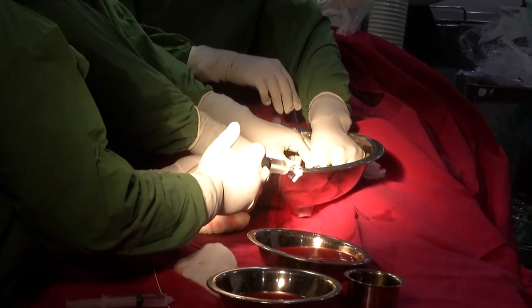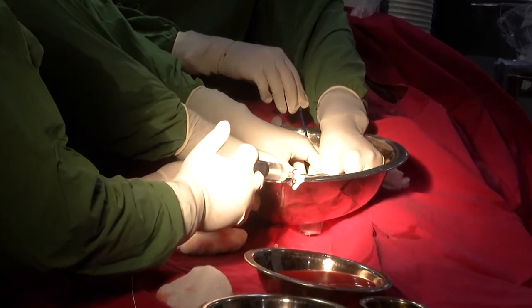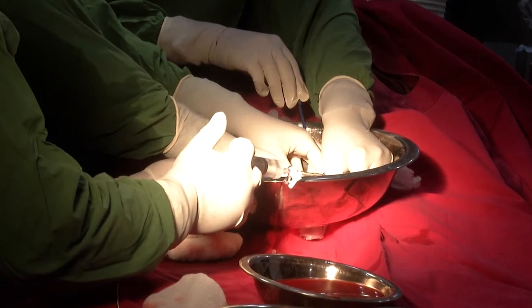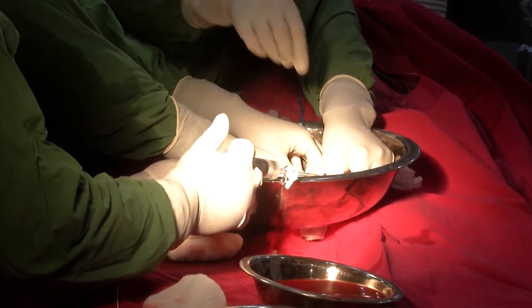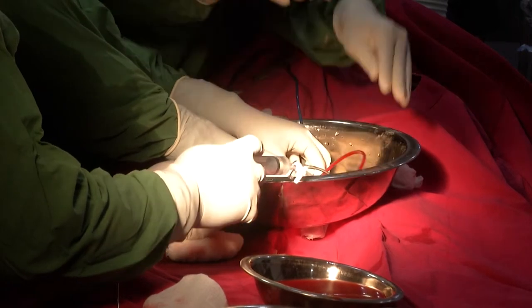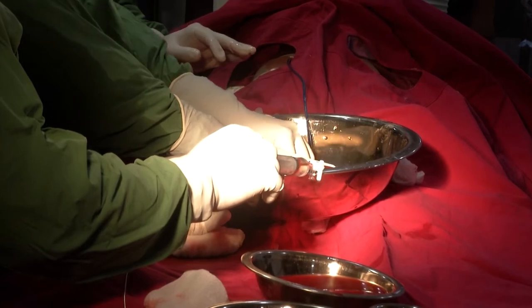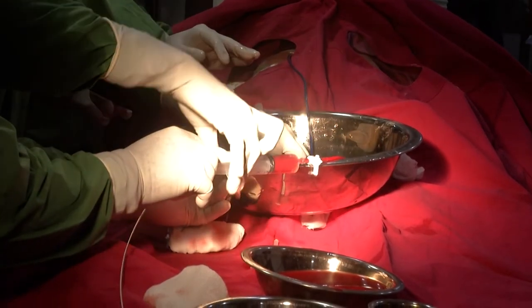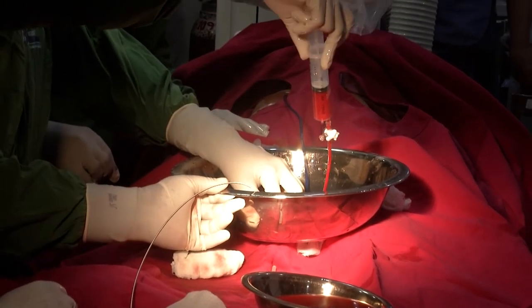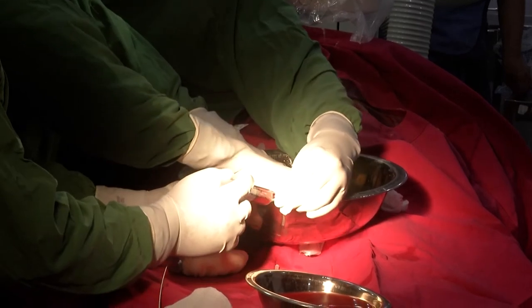Now I have immersed the delivery system under the water, and I will do everything under water. So now I am trying to de-air the delivery system and this cycle. We are flushing now. And then now we'll pull back. So you will see now that we are pulling back, and look at the syringe. Look at the syringe, you will see now that blood is coming. So this is the thing which we love to see, and there is no air.